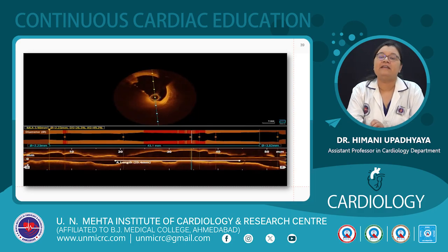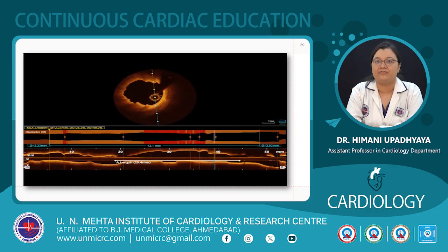So, in real time, OCT runs might look a bit different from the textbook images. So, there are some OCT runs for reference. As we can see in this OCT run, there is high thrombus burden, and then there is lipid-rich plaque with fibrous cap rupture with cavity formation, and that has caused ACS and STEMI in this patient.